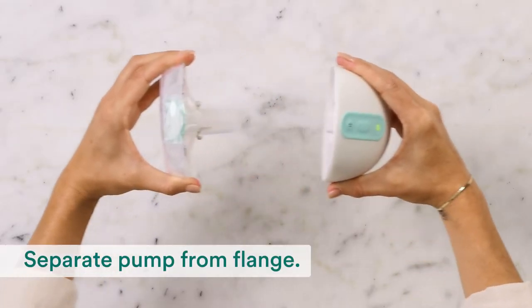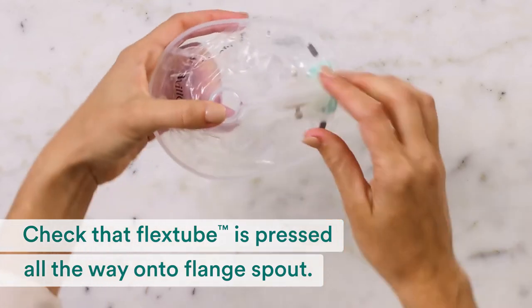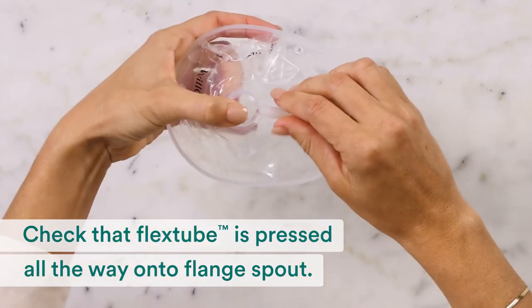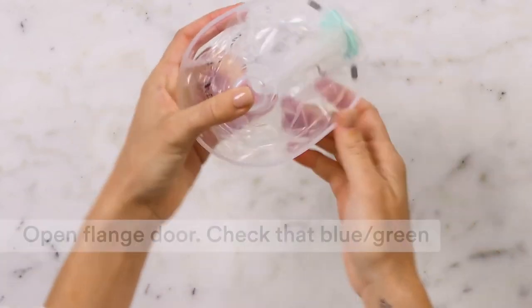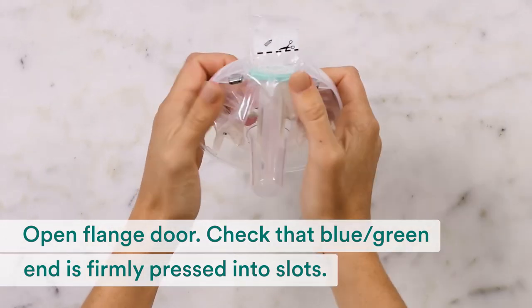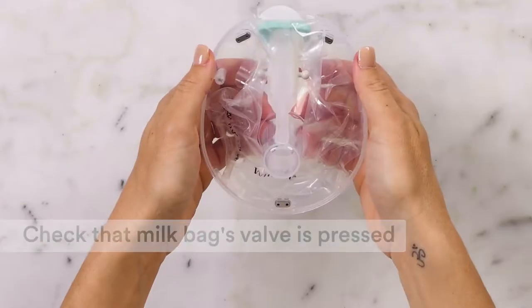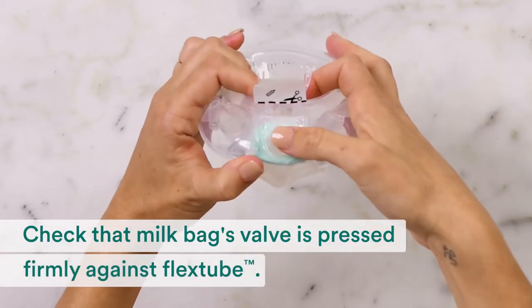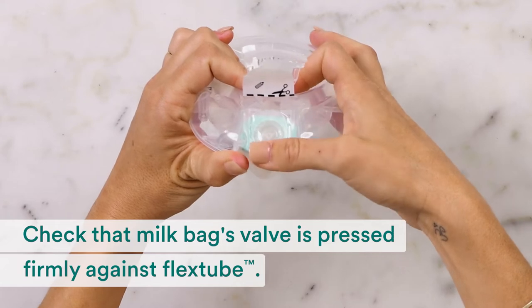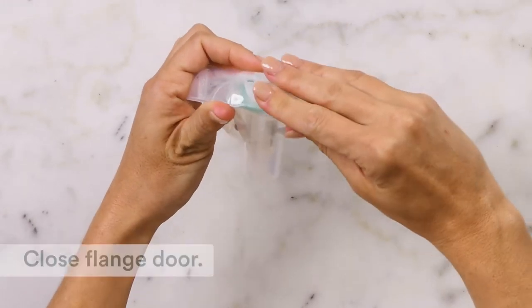First, separate the pump from the flange. Check that the flex tube is pressed all the way onto the flange spout. Open the flange door, and check that the blue-green end is firmly pressed into the slots with an audible click. Check that the milk bag's valve is pressed firmly against the flex tube. Smooth over the milk bag so it's snug against the flex tube, then close the flange door.